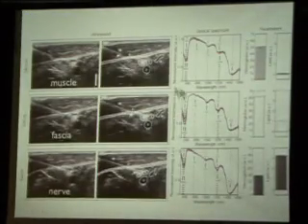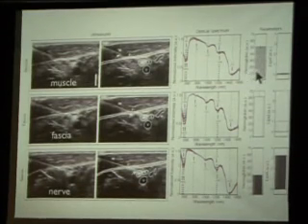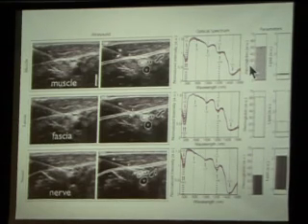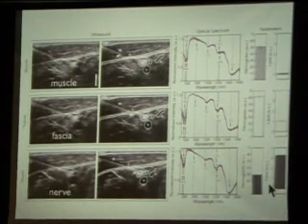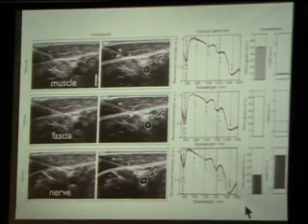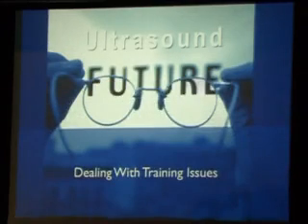So this is just a preliminary study looking at the amount of hemoglobin and lipid. For muscles, you will have a high percentage of hemoglobin, blood, and low concentration of lipid. Nerves, you have much higher content of lipid versus hemoglobin, so by that they are able to separate. So this is just the potential use of this technology in the future.